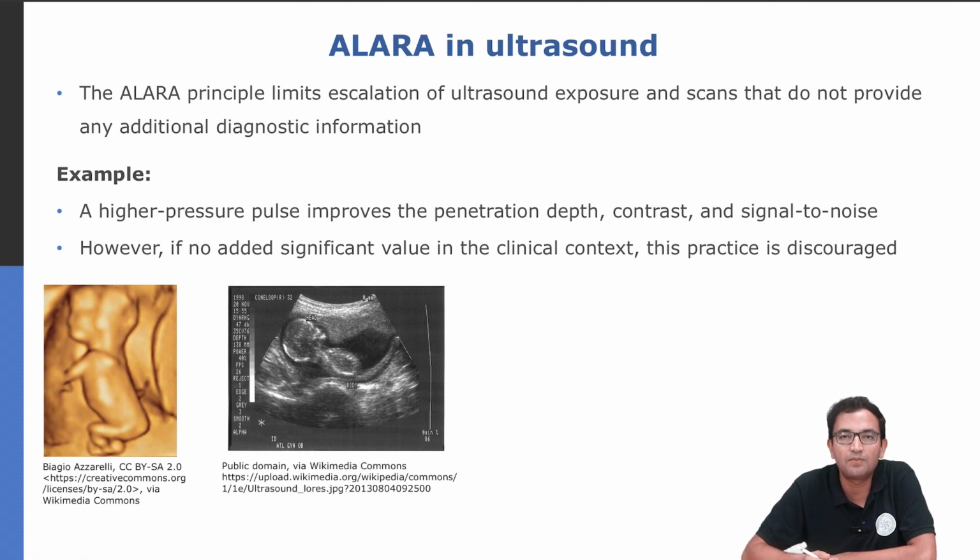And that's where the ALARA principle, or as low as reasonably achievable, comes into play. So, we should always limit the dose of ultrasound. The exposure in terms of intensities, duration, pressure, amplitude should be reduced to the extent possible, because if no additional diagnostic information is coming from higher exposures, then it is better to go with lower exposures.